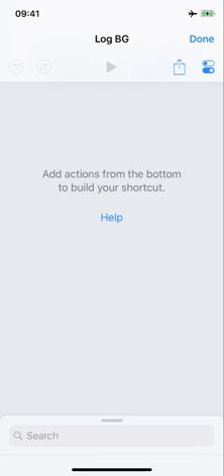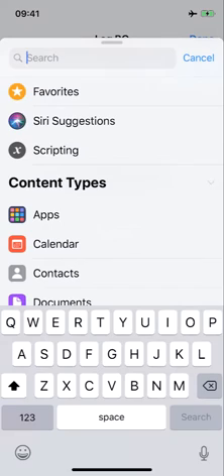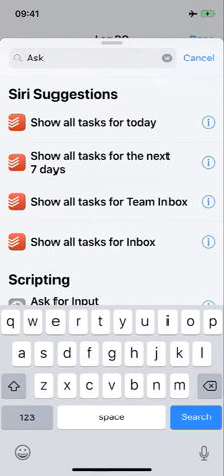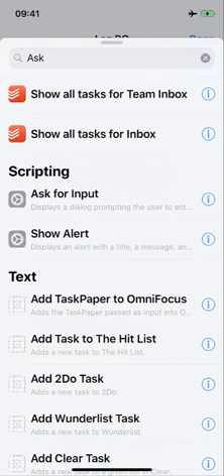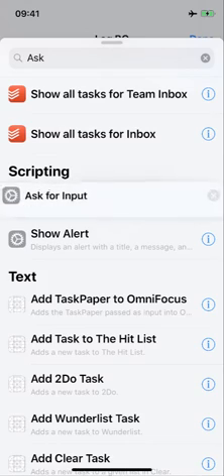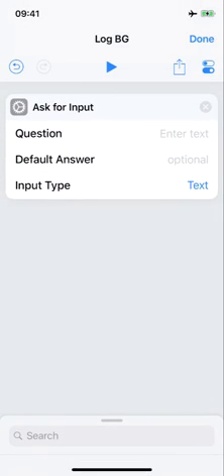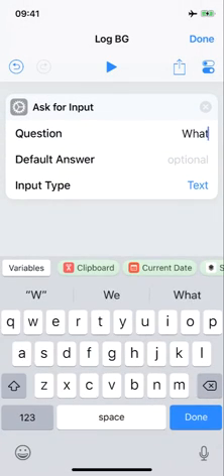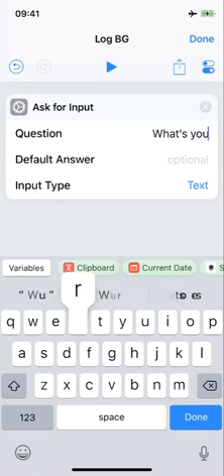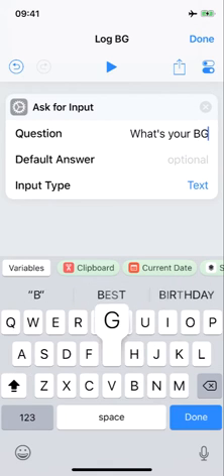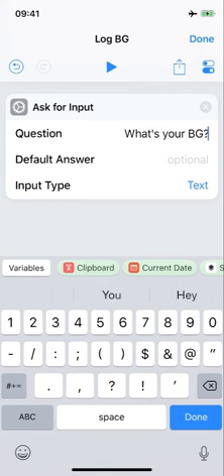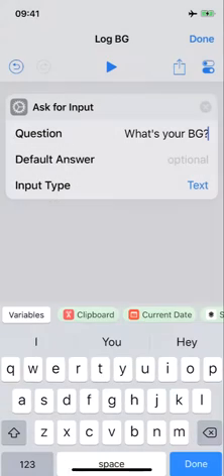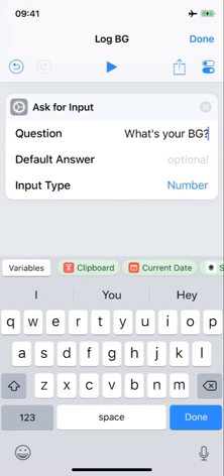And now we have to build our program. There are many ways to do this. There's a shorter way, but I'm trying to show you several little pieces. So first thing we're going to do is ask a question. So that is ask for input. And the question is going to be, what's your BG? And we need to tell it that it's a number.